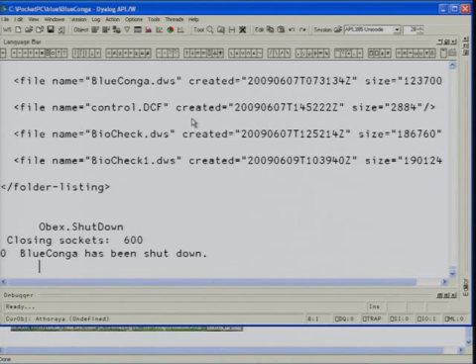What you would send to the server would only be an identification number. It wouldn't relate to a specific person, it wouldn't show any personal information. It would just be a random unique identifier. But even if the data was sensitive, you could encrypt it in some way so that what was being transmitted across Bluetooth, which typically is not secure, would make no sense to anyone. Unless you follow someone, and then you could just harm them anyway. Pick them up and steal them.